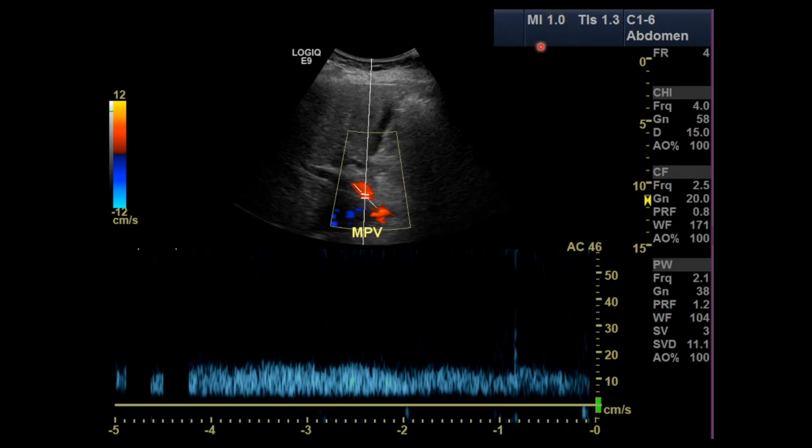When you have a high mechanical index, these are typically associated with lower frequency ultrasound waves and higher pressures and can create more mechanical effects such as microbubble formation, which can be harmful in some cases. The mechanical index is also going to change if you use contrast-enhanced ultrasound. If you're doing contrast-enhanced ultrasound, you don't want the microbubbles to pop necessarily. Keeping the mechanical index really low is important to preserve the microbubbles. However, if you want to destroy the microbubbles, increasing your mechanical index can be helpful. So this is the MI of 1.0.